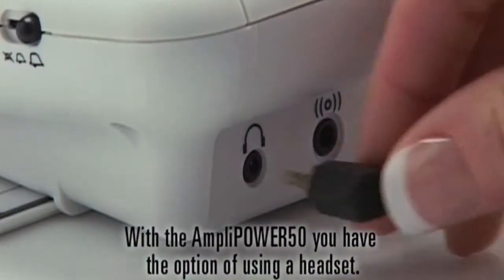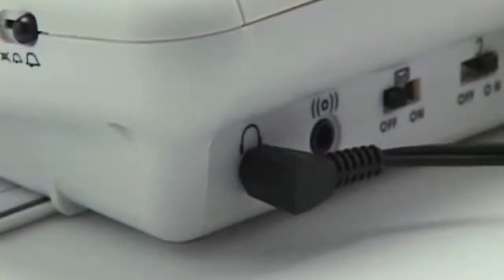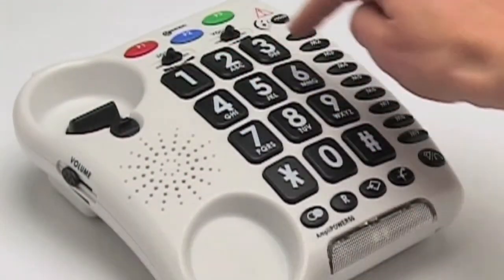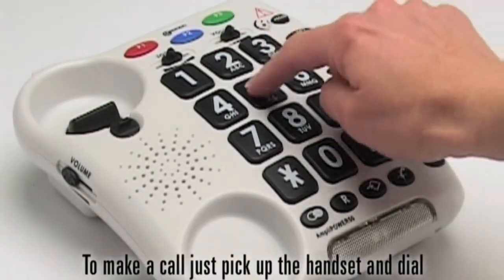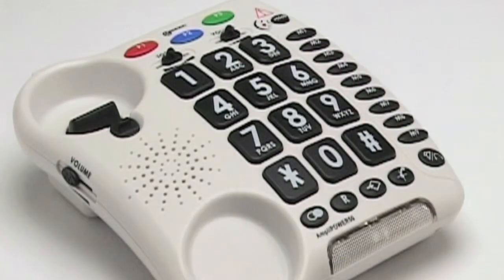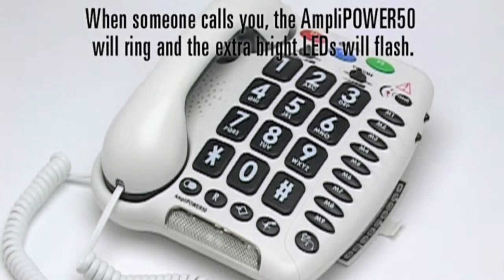With the AmpliPower 50 you have the option of using a headset. Once your phone is plugged in you are ready to enjoy hearing your loved ones again. To make a call just pick up the handset and dial or press one of your pre-programmed memories. When someone calls you the AmpliPower 50 will ring and the extra bright LEDs will flash.